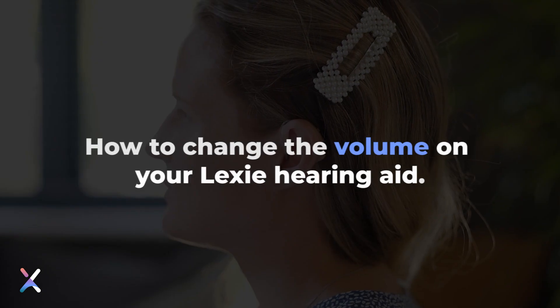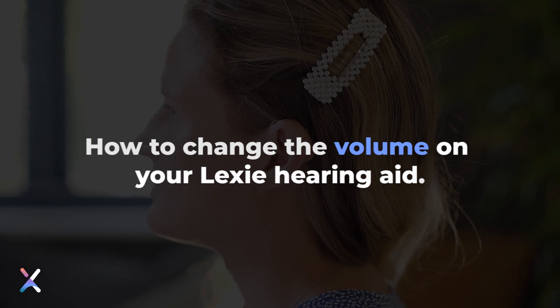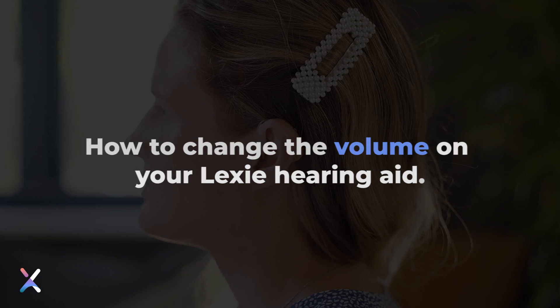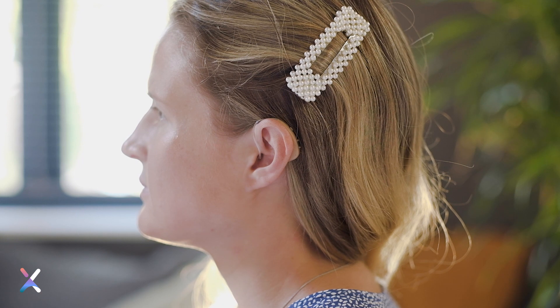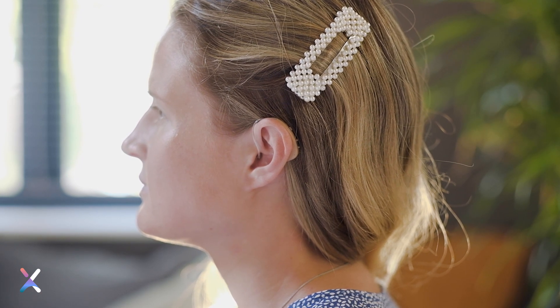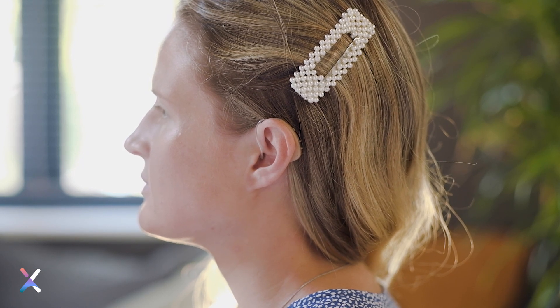How to change the volume on your hearing aid. Every time your hearing aid is switched on, it will be set to the default volume for your hearing loss. This is also called the middle or comfortable volume. If you switch the hearing aid off and then back on again, it will return to this default volume level. Your hearing aid can be made louder or softer from the default volume level.